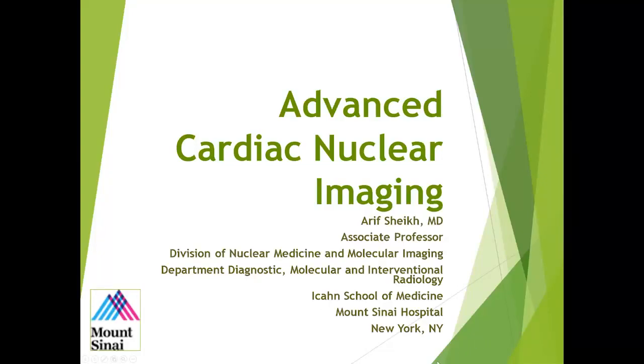Welcome everybody to the next talk in nuclear cardiology. This one is in advanced cardiac nuclear imaging. I'm Dr. Arif Sheikh from Mount Sinai Hospital in New York, and this is part of the series of cardiac nuclear medicine. The other two belong to basic SPECT imaging and cardiac PET imaging.